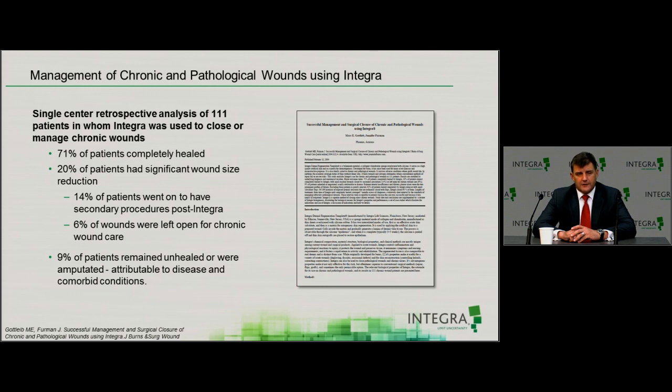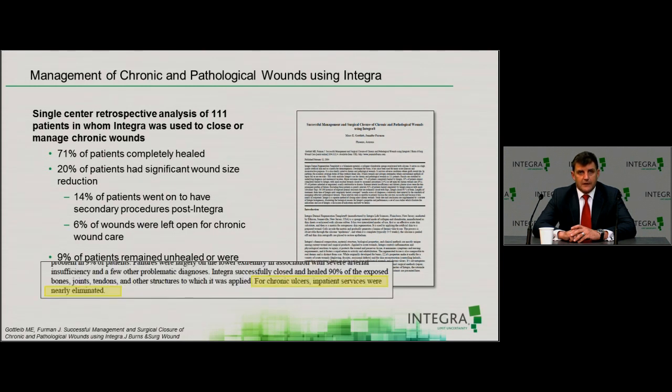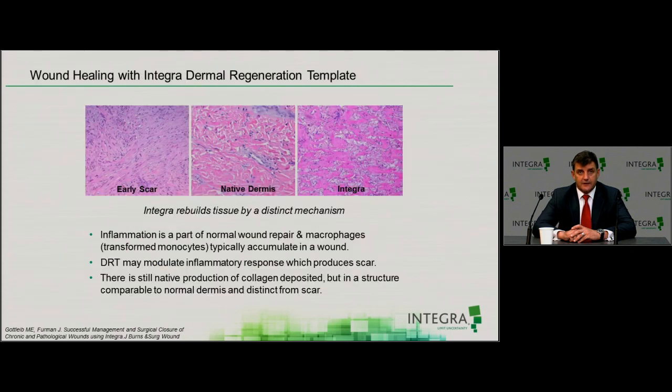And this was really because this was not a prospective randomized efficacy study. These patients were very real-world patients like you and I treat, patients with poor diabetic control. They had various other problems, obesity, maybe were on oral corticosteroids for some sort of inflammatory process, etc. So this was a real-world experience. Interestingly, most of these patients did not need other significant inpatient services, so after debriding them and applying the dermal regenerative therapy, they were able to really keep them out of the inpatient system, which is a significant cost savings for any of us in any of our healthcare systems.